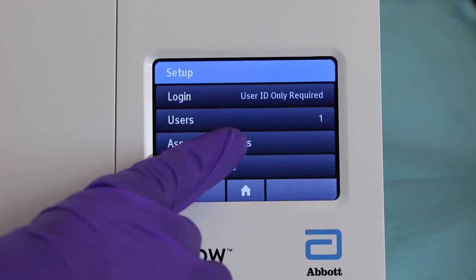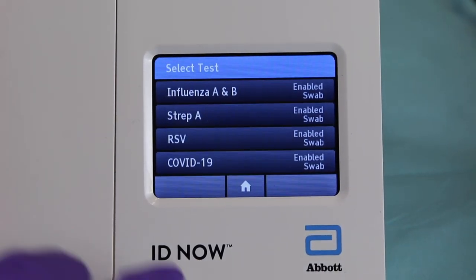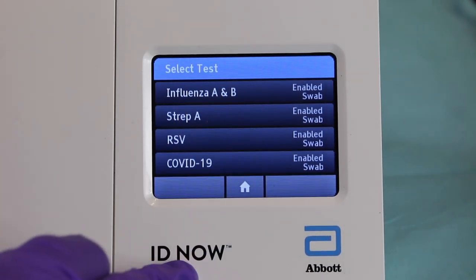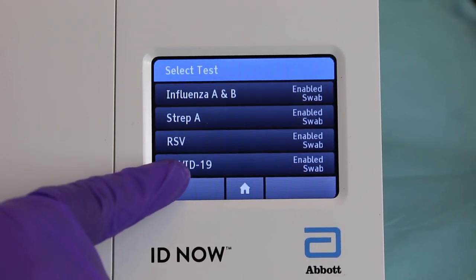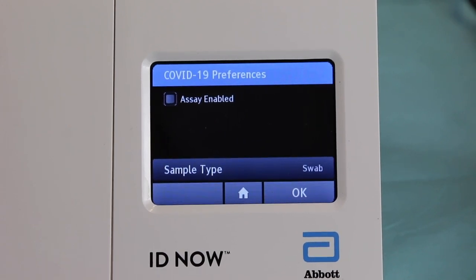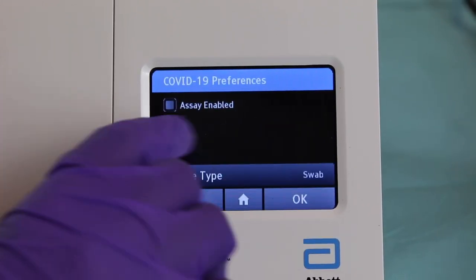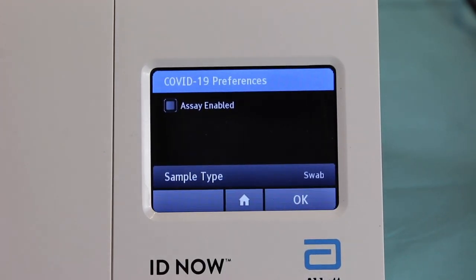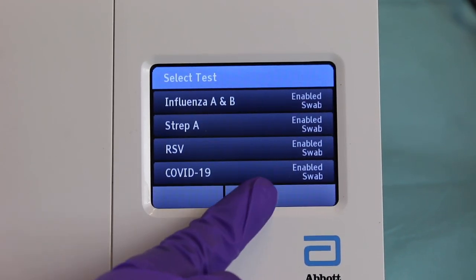Setup will also give you the preferences. If you hit the preferences button, this shows you all the different tests that the machine is able to perform. However, we're only doing COVID-19, so select COVID-19. Enable the COVID-19 test and hit OK because it is enabled, then go back to home.